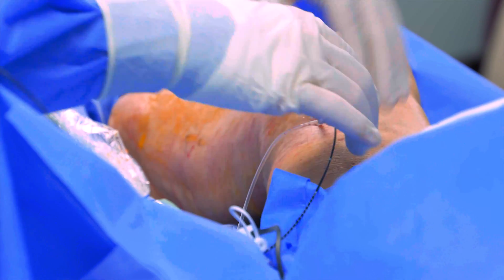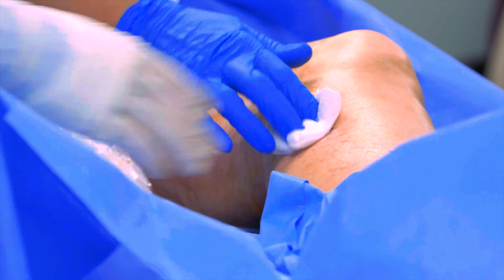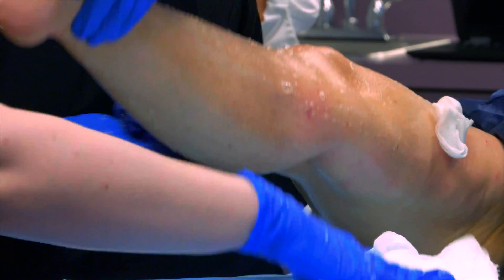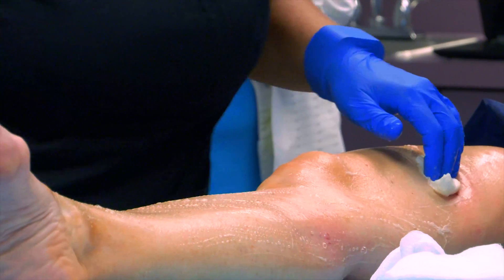The procedure itself will only last a few minutes. There is generally very minimal blood loss, and other than a few needle sticks, very little discomfort. The leg will be washed to clean off any remaining detergent, and pressure will be applied to the site of insertion.